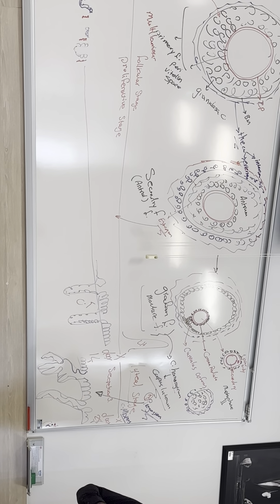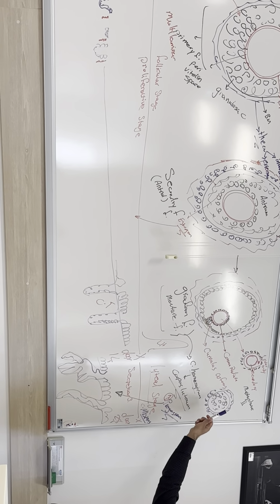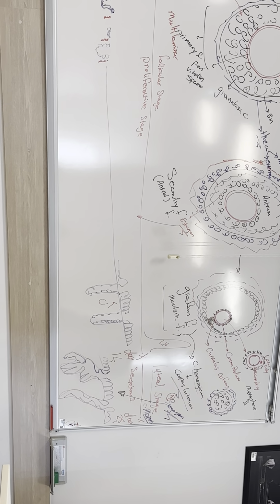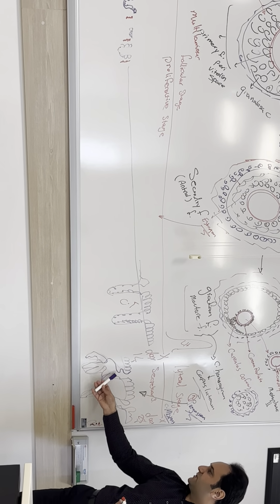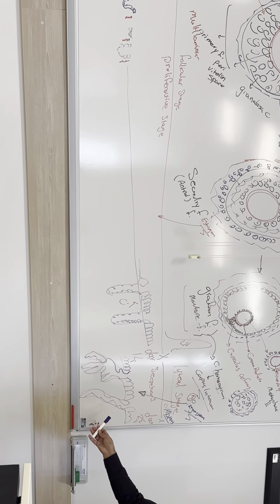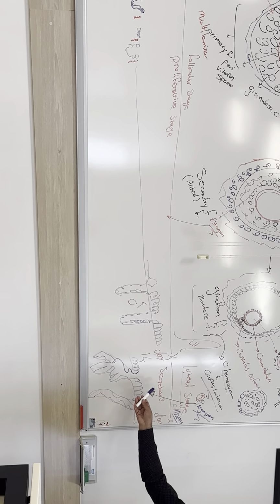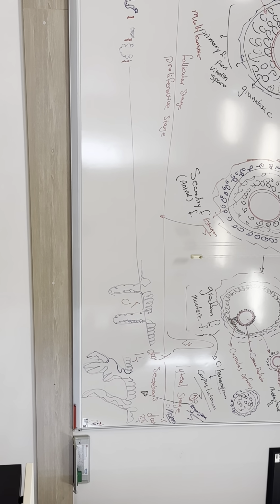This secretion is affected by the progesterone, which comes from the granulosa lutein cells and theca lutein cells. Remember the luteal stage. Because of this secretory function of the endometrium, this stage is known as the secretory phase or secretory stage.